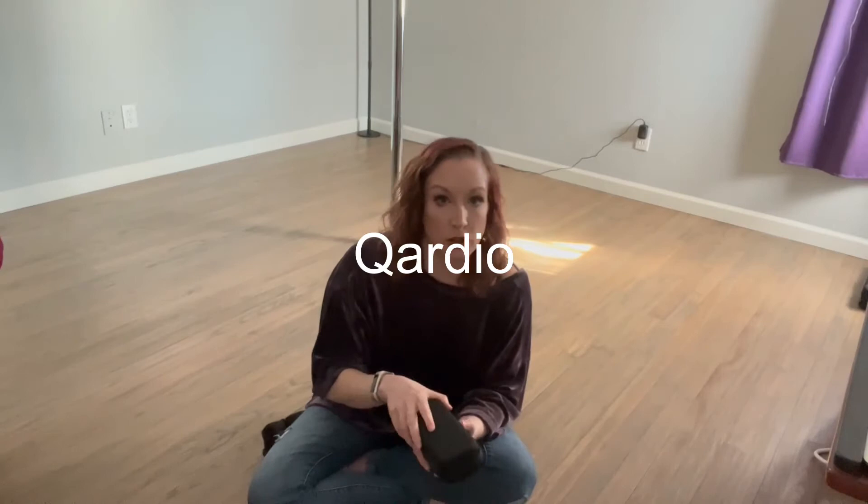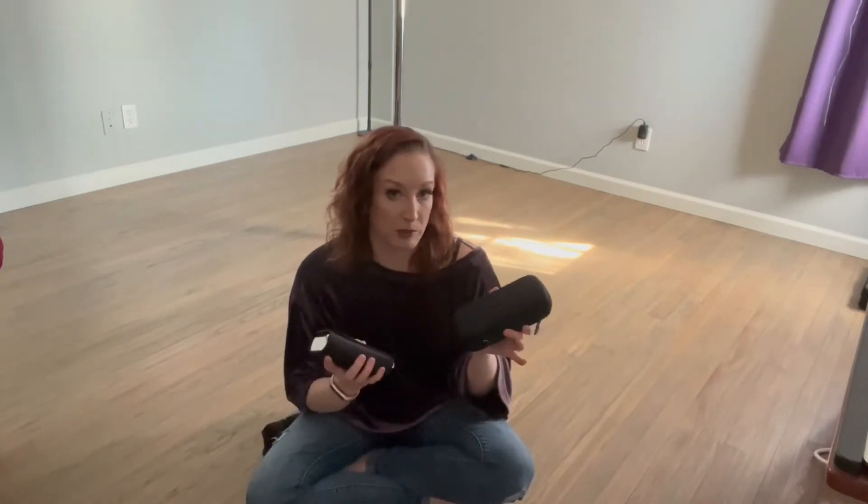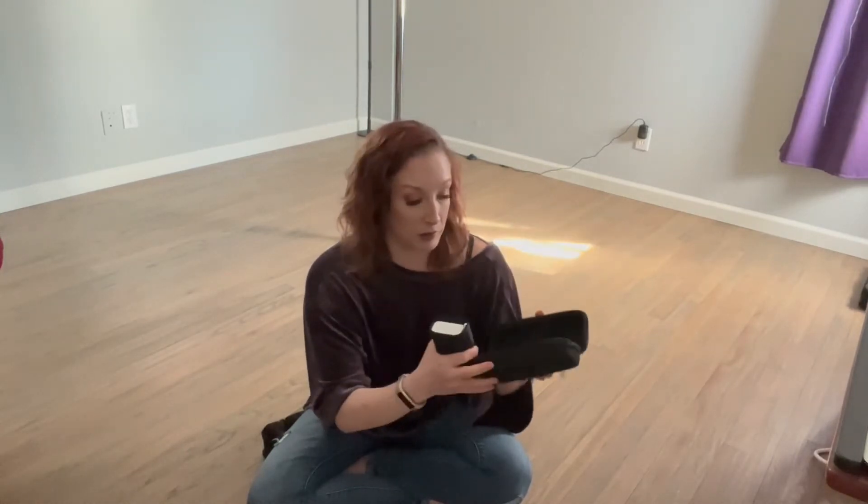This one is from Qardio — spelled with a Q — and it comes in a little case. I got mine from Amazon; Qardio has their own website but it was available there too. The case has pockets where you could store extra batteries, since it is battery-powered. Once you get the device, you put the app on your phone and sync it with the Qardio Arm — that's what this is specifically called. They also have a smart scale and other products I haven't checked out yet.